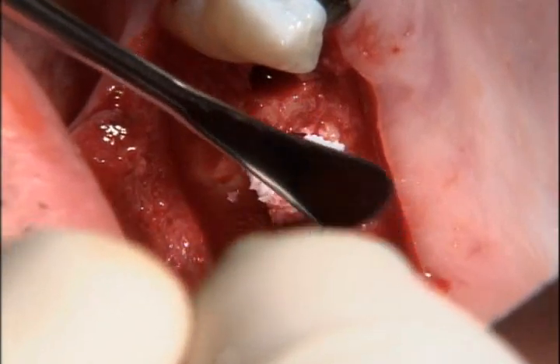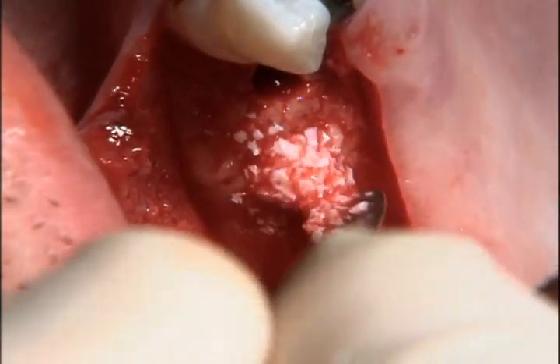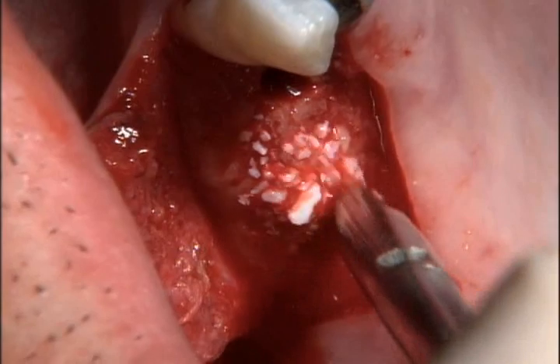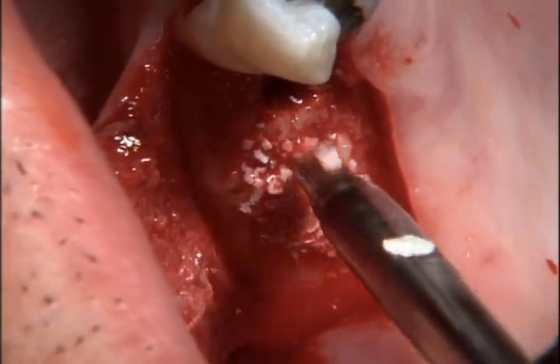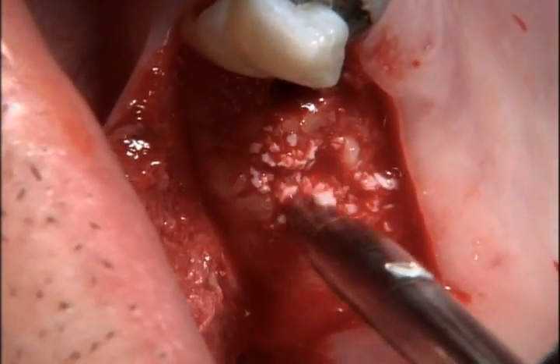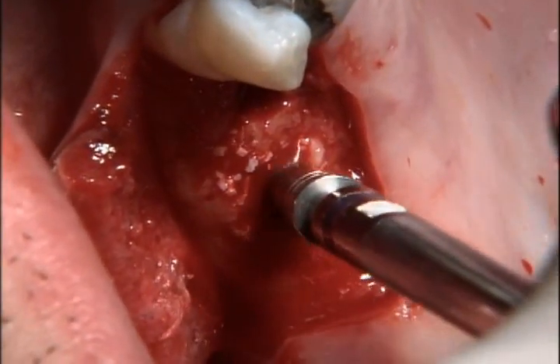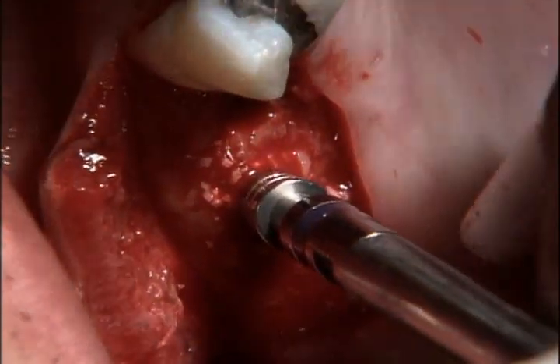At this point, it's generally wise to add a graft material of mineralized particulate cancellous bone to supplement the autogenous bone plug that has already been collected at the apex of the osteotomy. This is done because a significant sinus floor elevation of approximately 3 millimeters is needed at this site, and the graft material will help to tent up the Schneiderian membrane and to stabilize the implant apex.